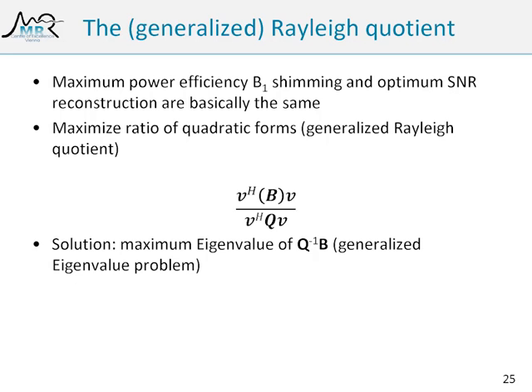That was in the very first phased array paper by Römer already. And the second scenario you have, for example, for a transmit coil, is you say at this one point, I want to have the maximum possible B1 field.